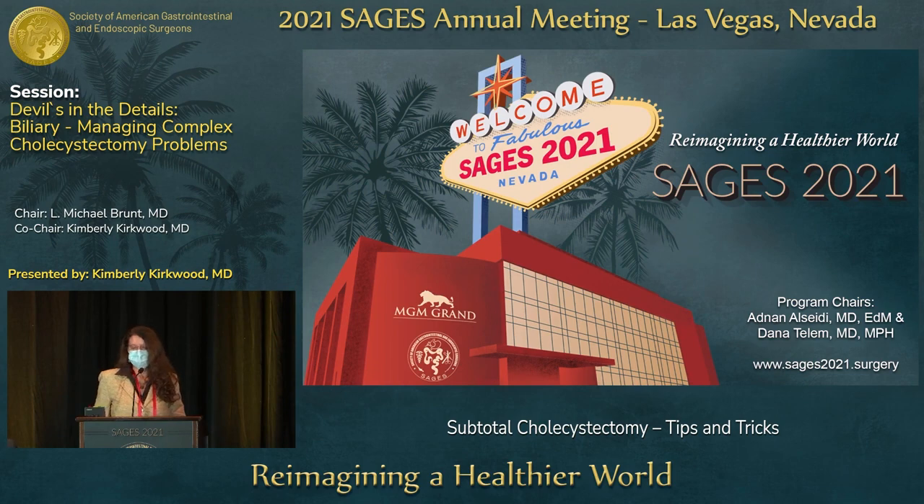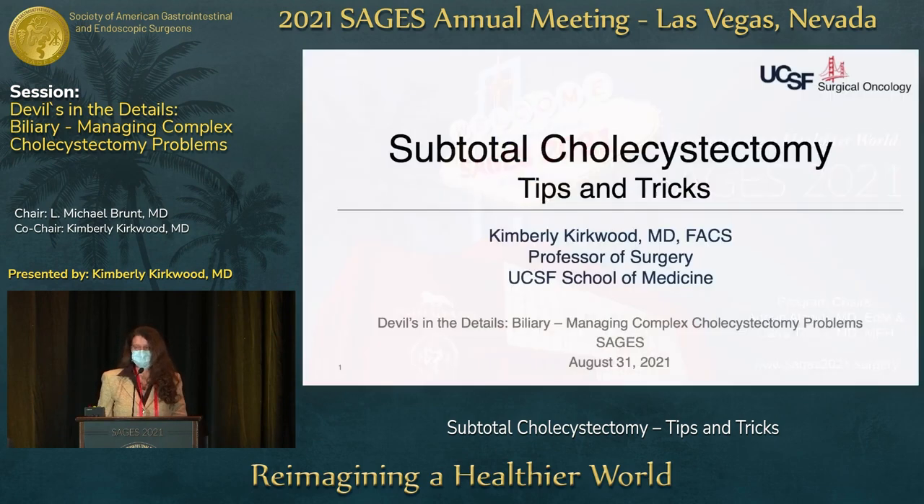Hi, I'm Kim Kirkwood, and I'm going to talk very pragmatically about a technique for doing subtotal cholecystectomy. This is essentially a hybrid approach — a fundus-first with a twist and a subtotal. The technique has evolved over time.